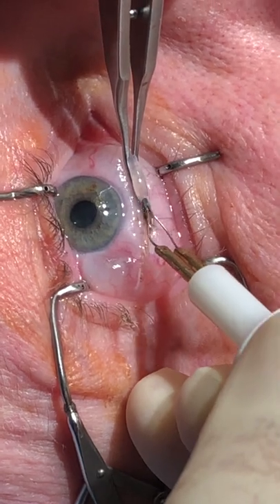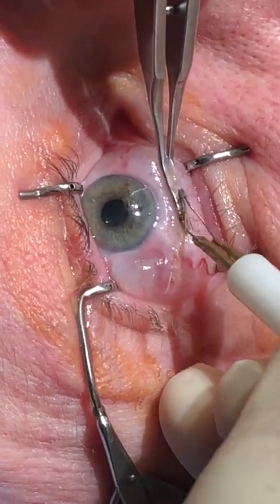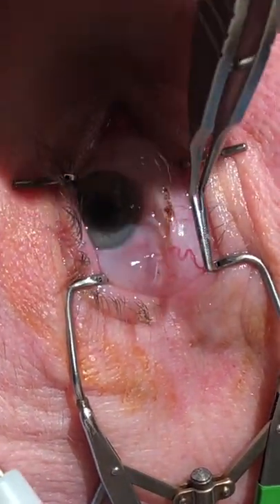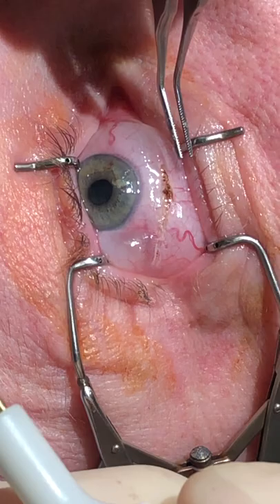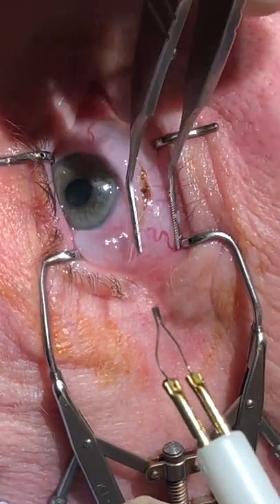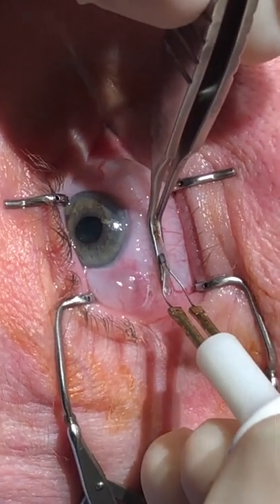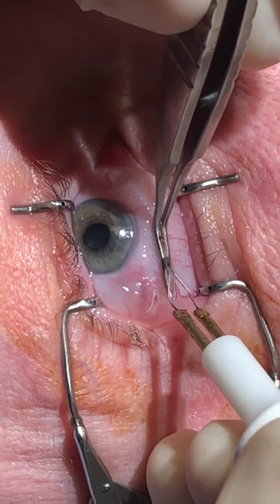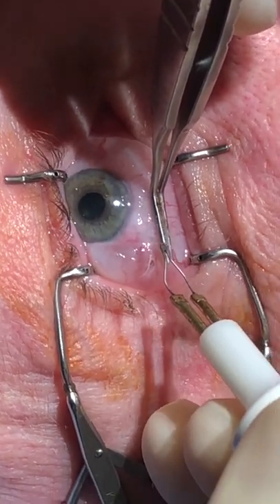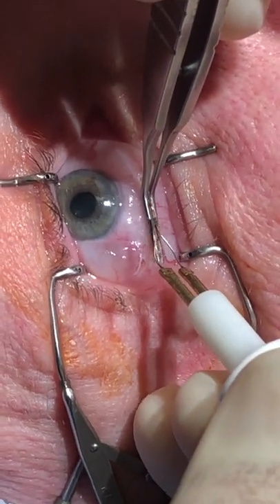Conjunctivochalasis is typically mid to temporal, so unless the patient has problems beyond temporal, I usually go mid-pupil and beyond. We're just little by little getting that excess conjunctiva here, and we're just cauterizing — this puts both the conjunctiva and Tenon's layer together.